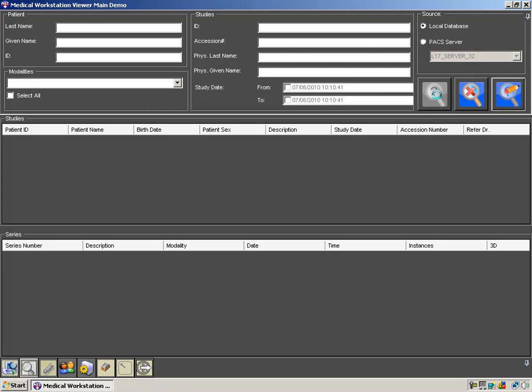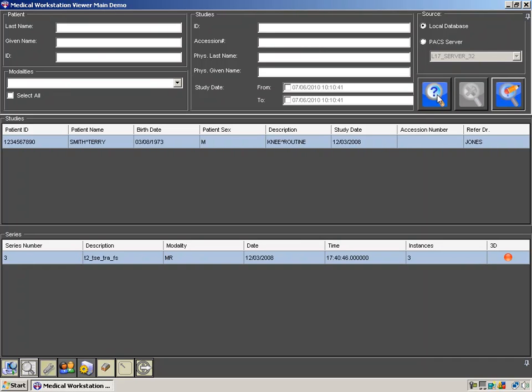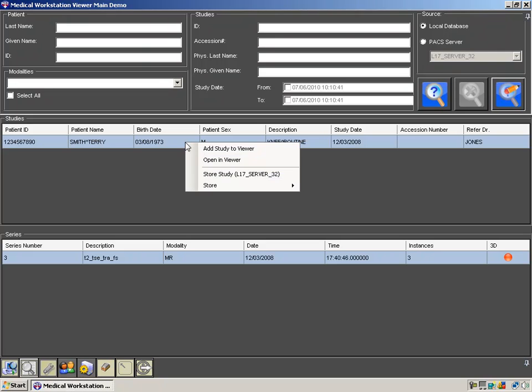Once the results come in, bring up the context menu by right-clicking on either the study or the series.